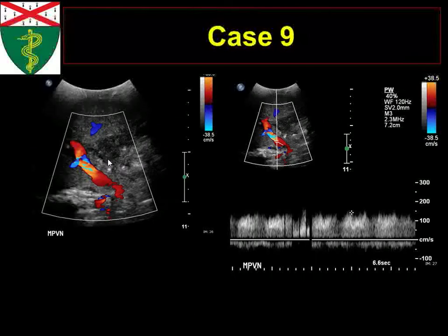And so I don't see the hepatic artery. We tried really, really hard, and we weren't able to find the hepatic artery. This is a post-op patient. What are you worried about? Thrombus. And what else do you see on this image in terms of the grayscale appearance? That's the liver, that kind of dark, hypoechoic area right there. So that doesn't look too good either.